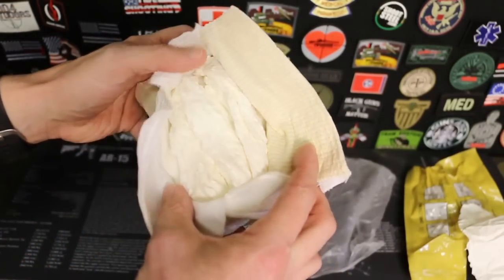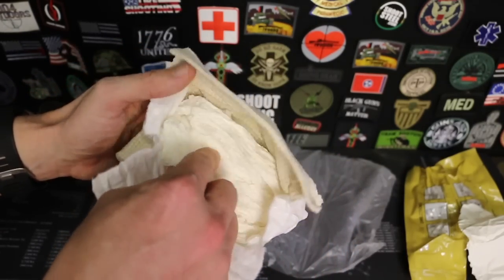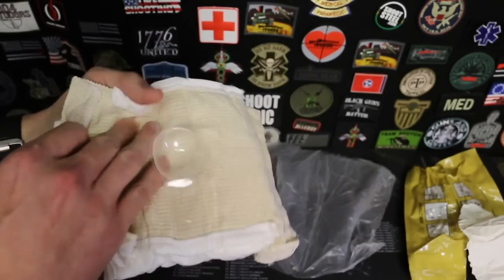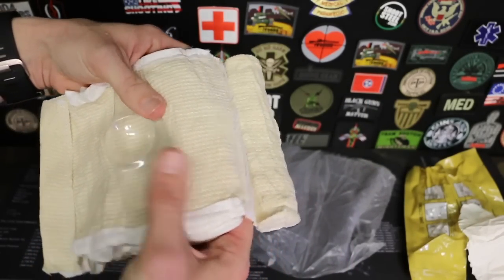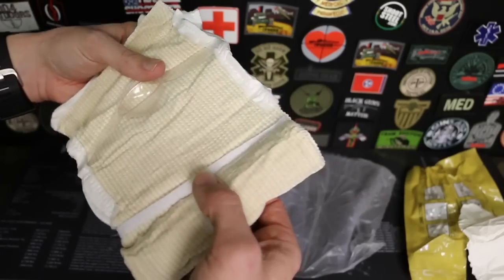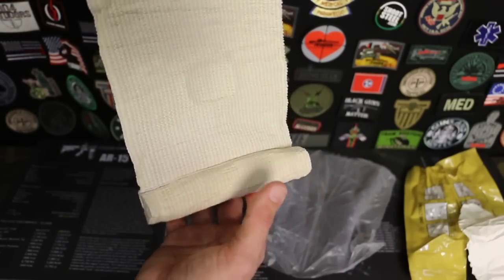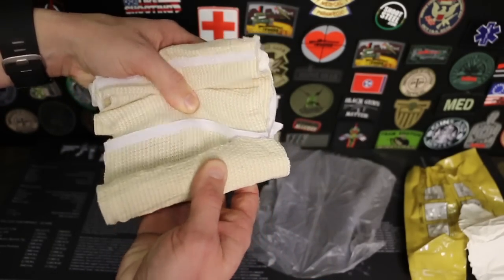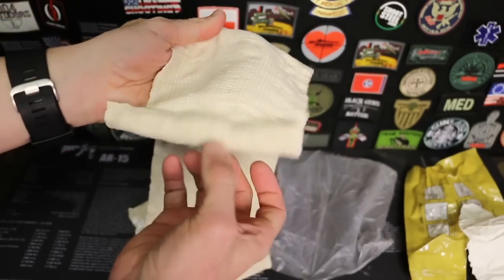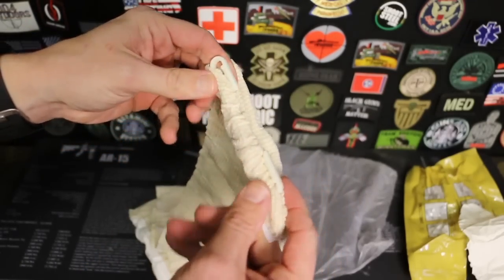You can also pull out this gauze. The thinking is if you have an entry and exit wound, you can pull this out, put it on one side, then go to the other side and roll this on. It has a pressure cup as well - that just adds more pressure to the wound. It has a Velcro tab so it doesn't come unrolled on you; you can start unrolling it and it catches at the top and bottom. It also has the plastic clip at the end, like we're used to with the Israeli bandage, so when you get through wrapping it, you put the plastic clip on.